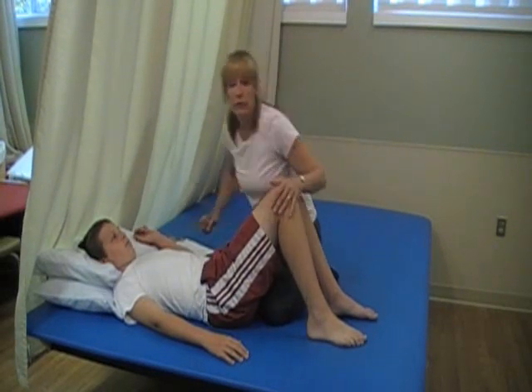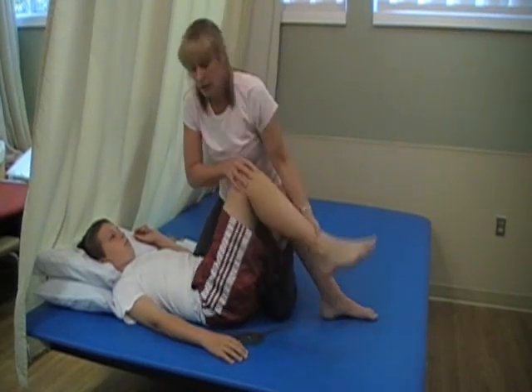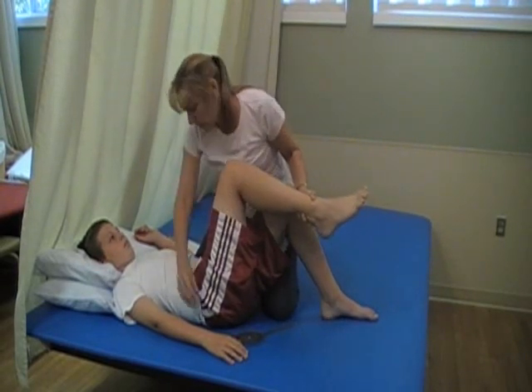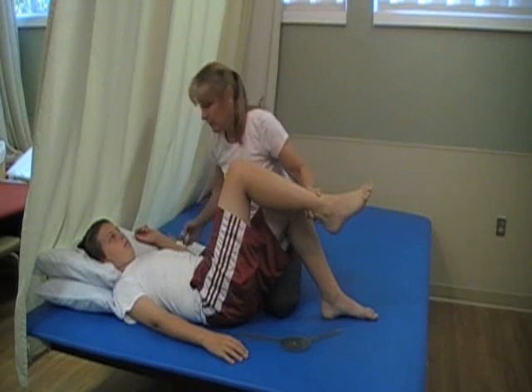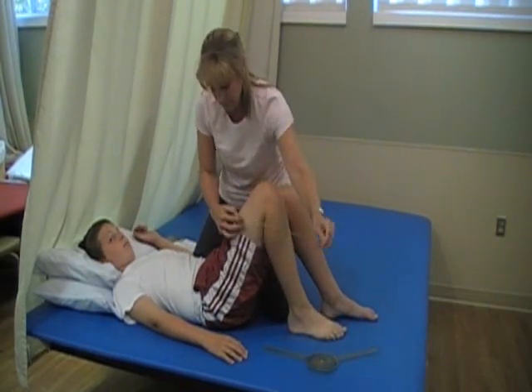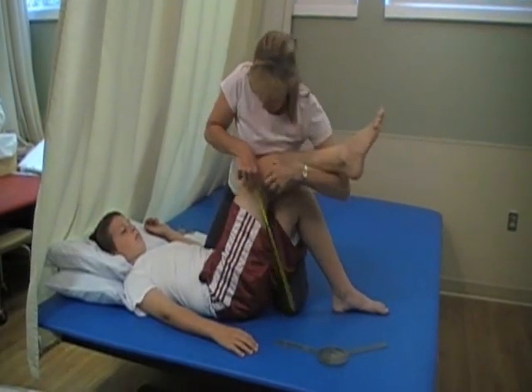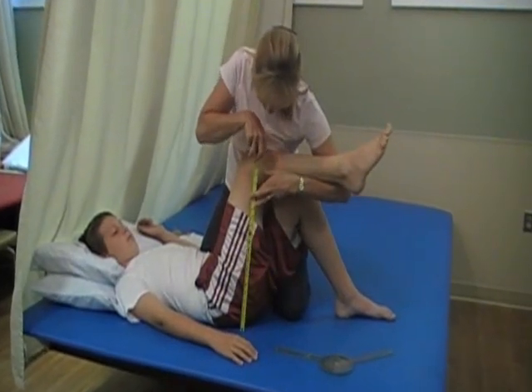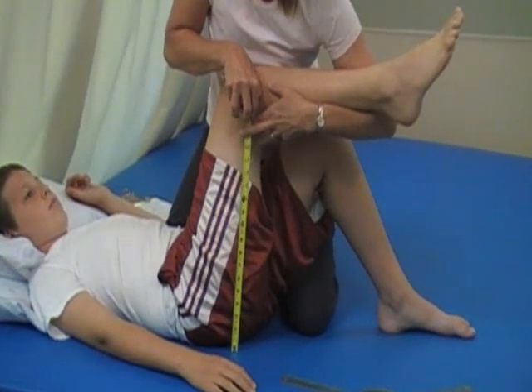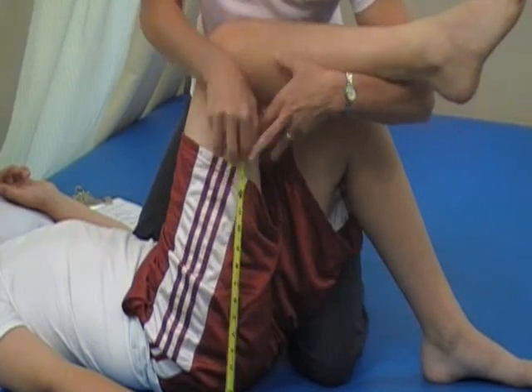The other thing you want to do in this position is take some critical measurements. We've already talked about the hamstrings, where you're looking at the maximum range of motion. The other thing you want to look at is you want to measure the firm surface to the back of the knee. And if you're using the form that was given to you, this is M. So you're looking at the seat depth on both legs.